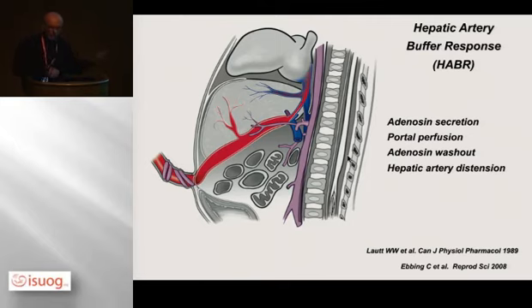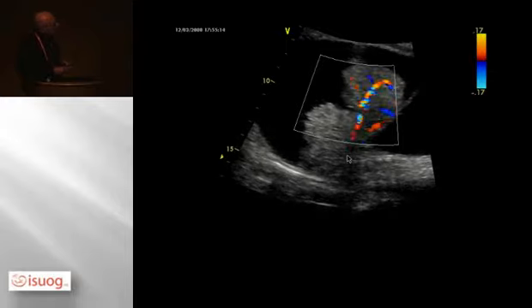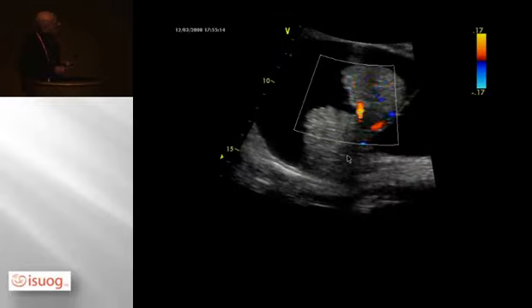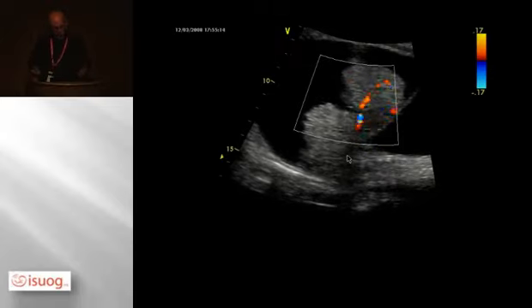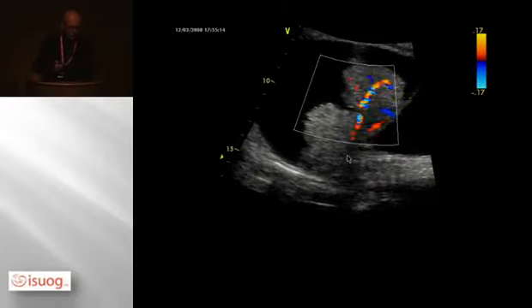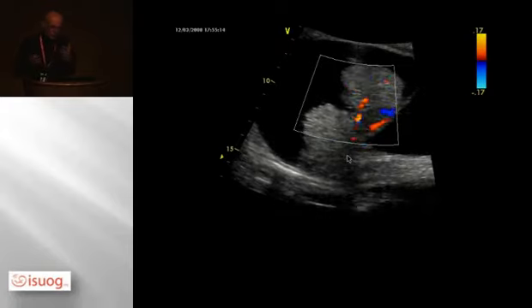The umbilical artery is perfect. The cerebral artery is perfect. But this is not perfect. This is a sagittal view now of the ascites, the liver, the pleural effusion, the bowel. And what is this? That's the hepatic artery. So if you can't keep up pressure in the umbilical or the portal system by the umbilical vein, you have to take the next resource, artery. The hepatic artery is not able to substitute what comes from the umbilical vein, but somehow to compensate.